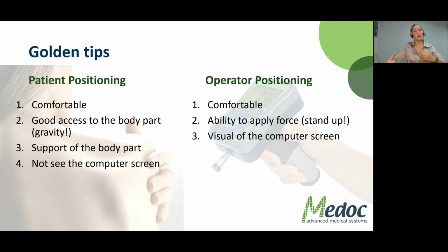Where is the computer? Where is the patient? How is the patient seated or lying down? What body site am I going to reach? And in which order am I going to do this? So you don't move the patient around too much.